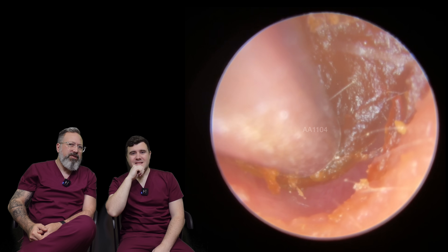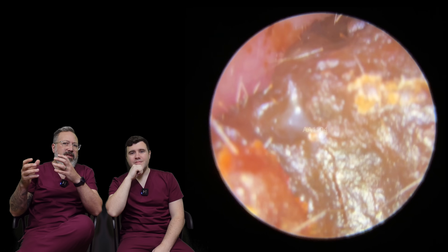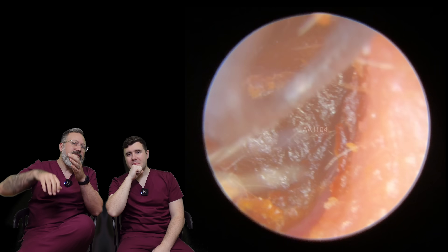I was like, why is this not budging? Sometimes it's either going to be a bit of dry skin, or it can be that it's deep in the recess.